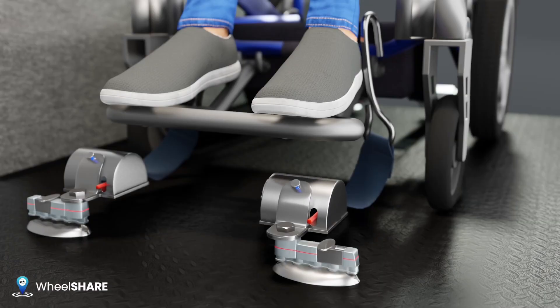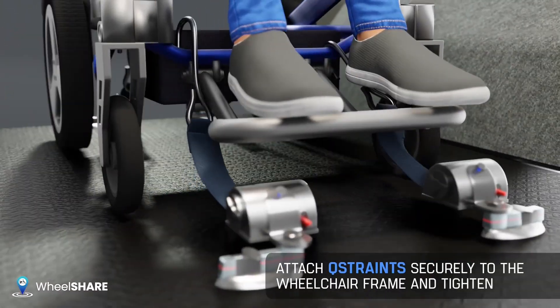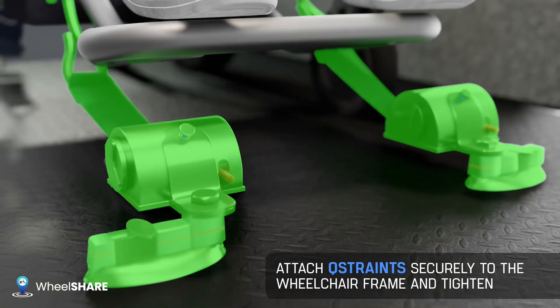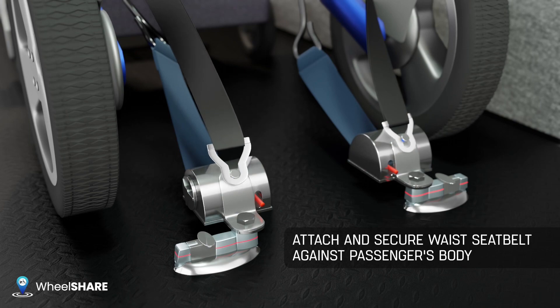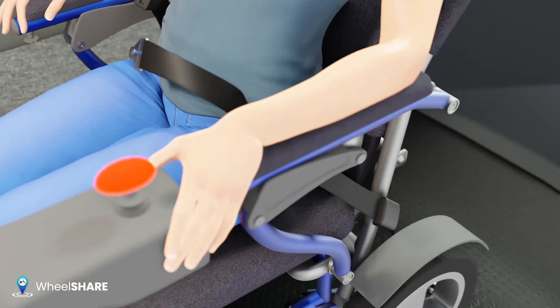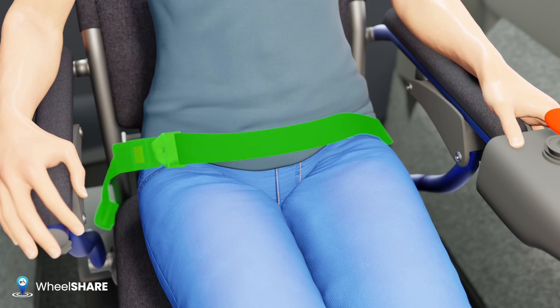There must be two Q-straps behind the wheelchair and two in front. Attach the seat belt to the rear Q-straps. Thread the waist seat belt through the wheelchair frame, ensuring it is directly against the passenger's body.